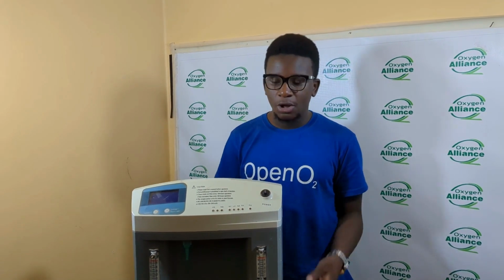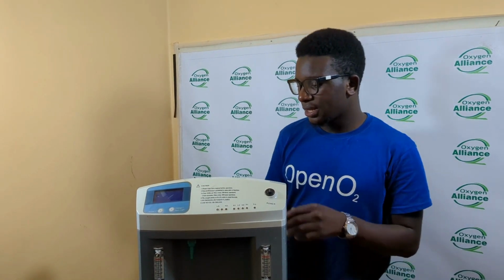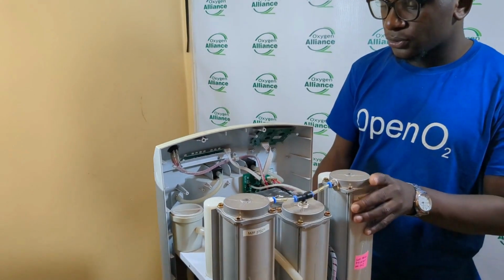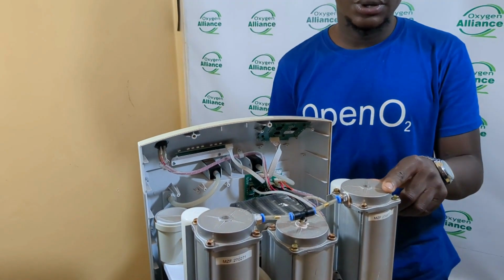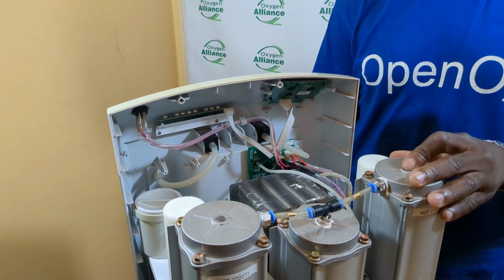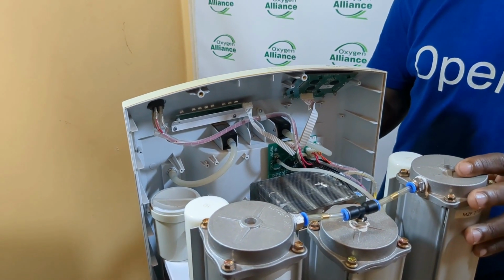So inside the J5 oxygen concentrator, we have three printed circuit boards. One for these indicator lights, one for the LCD, and the main control board. In order to access the main control board, you have to open the covers of the oxygen concentrator. If you don't know how to do this, we have a previous video about a J5 oxygen concentrator that will explain this process in detail.